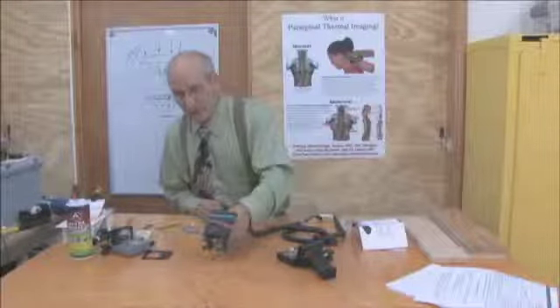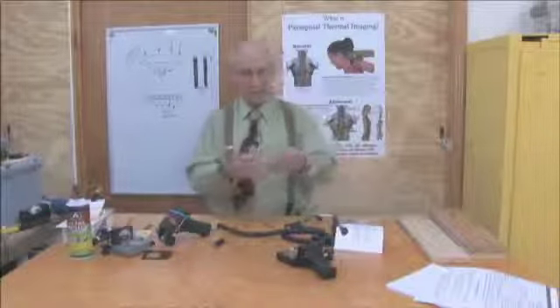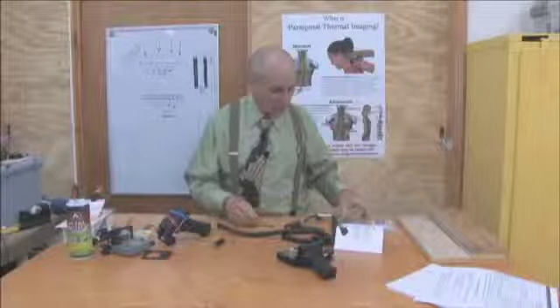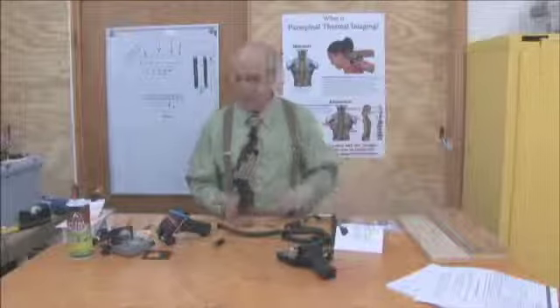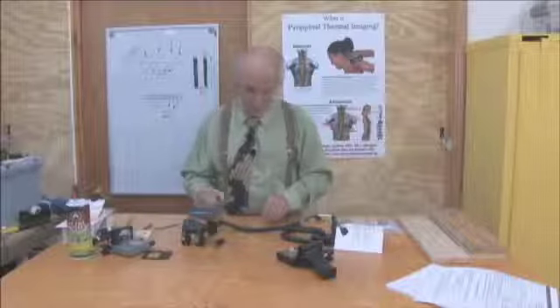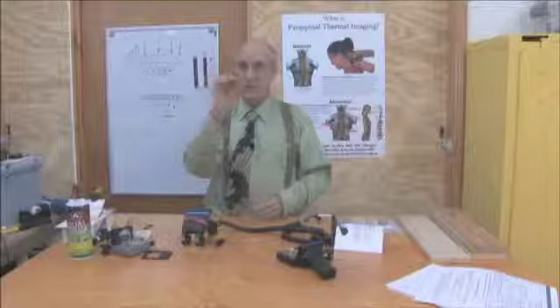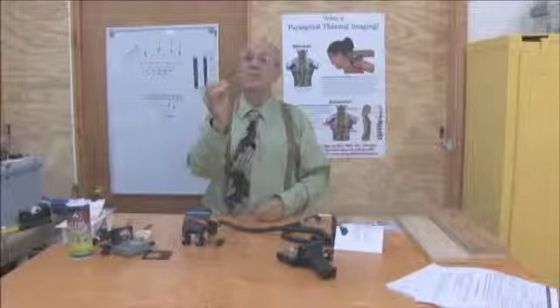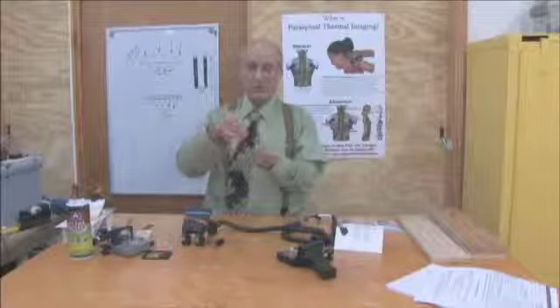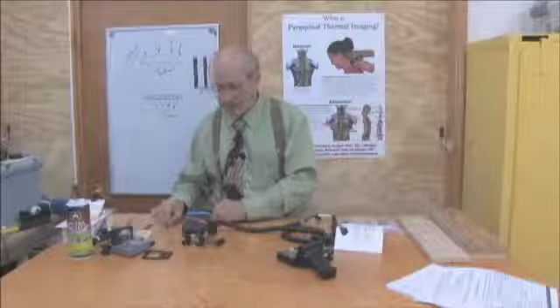When we shear off the screws and they need to be replaced, in your scanner case, there's a repair kit. And the repair kit has in it extra screws, and it also has extra wheels should you ever lose the rubber tire on the wheel. The screws have an Allen head, and we include a ball end Allen wrench. And when I say ball end, it's a nice spherical end that will fit into the head of the screw, even if there's a slight angle between the screw and the Allen wrench.